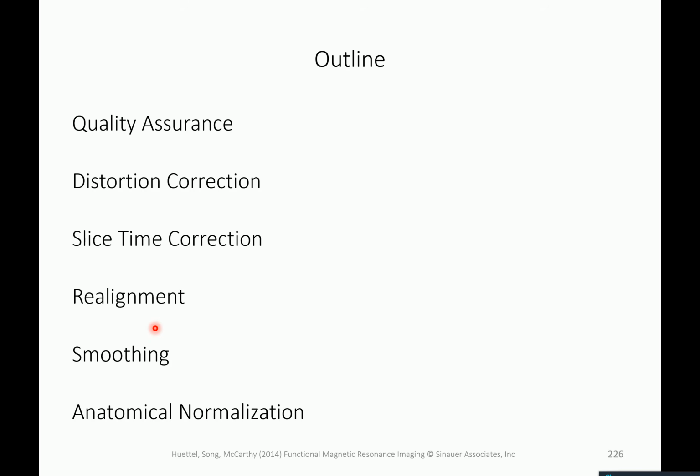But what I want to say, and this is also why I go over preprocessing quite quickly, I could also do a full course on computational anatomy. For the interpretation of fMRI studies, the preprocessing is not that important. The interpretation is completely determined by the statistical analysis that you do, whether you do a GLM analysis, a DCM analysis, maybe an MVPA analysis.